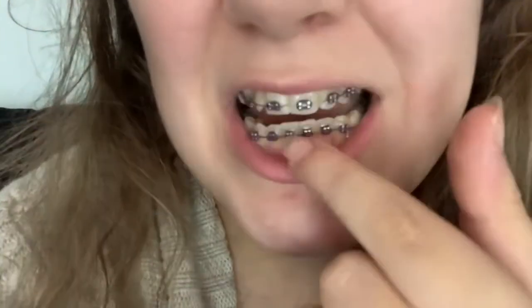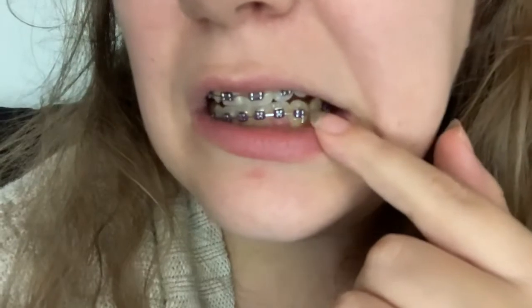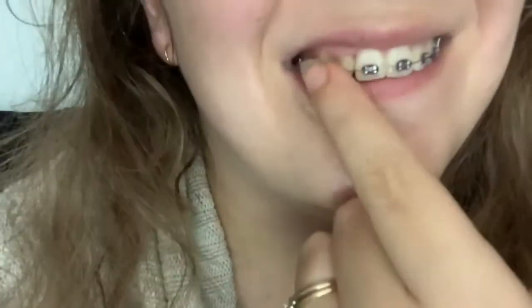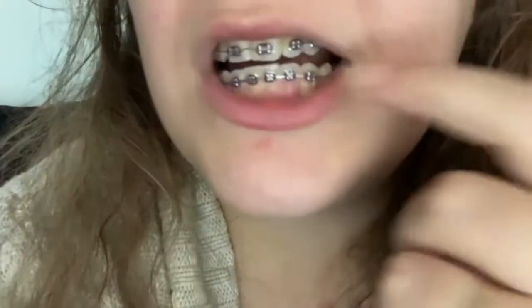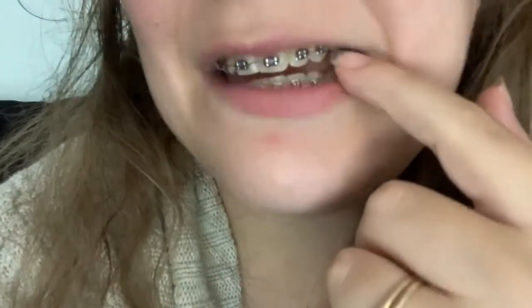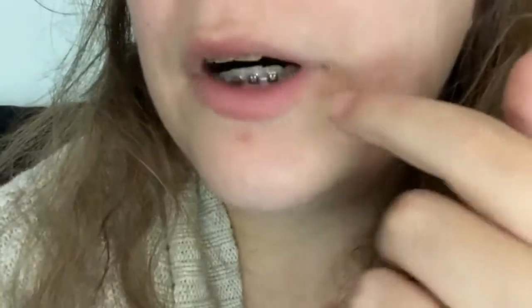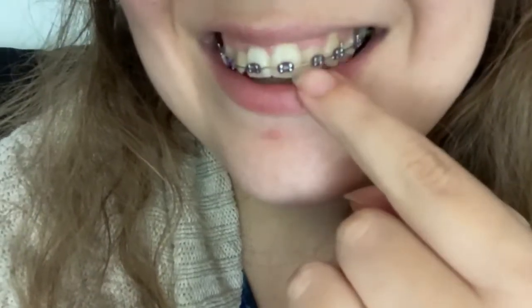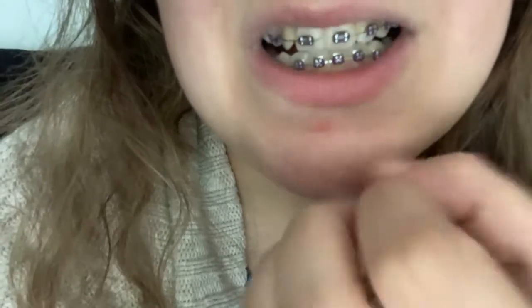So we just put on, apparently, the thicker, stronger wire that is more firm than this wire. This wire is still very bendy because they're trying to get this tooth here to just turn more. So they kept me on the same wire and took out the power chains and just gave me regular bands all along and made them purple. Whereas down here, apparently I went up to the more firm, thicker, stronger wire. It's probably not the strongest, but I went up to the next level so that it's not as bendy and flexible as this one. So there's not as much give as there is up here. This one is a lot more, trying to make sure there's not as much spring back or anything.